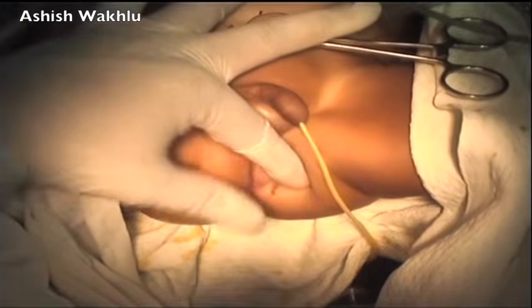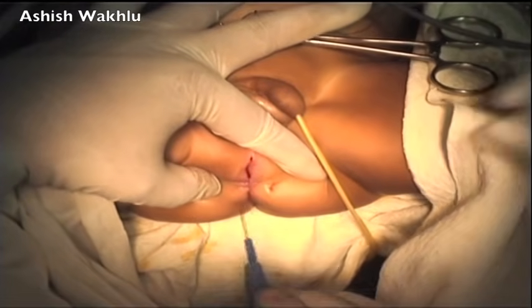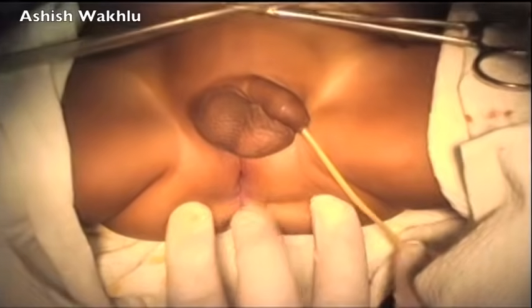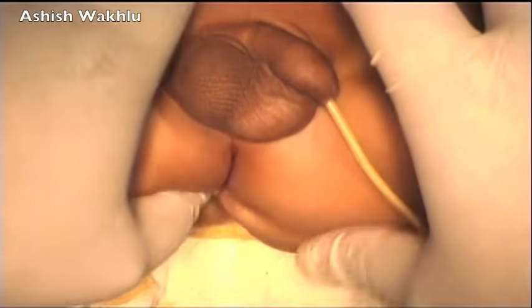After mobilizing the colostomy, we proceeded to do the perineal dissection. As mentioned, this child had had an attempt at perineal digging, and this caused a bit of scarring at the site of the neoanus, and you can see the dimples where this digging was done.